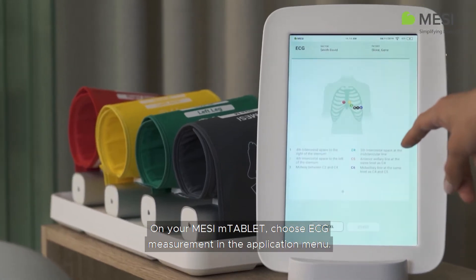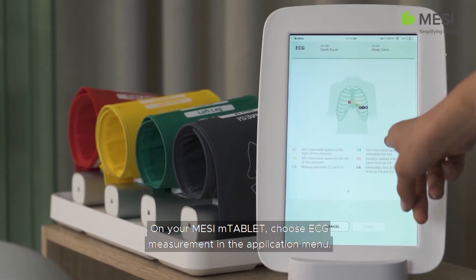On your MESI mTABLET, choose ECG measurement in the application menu.